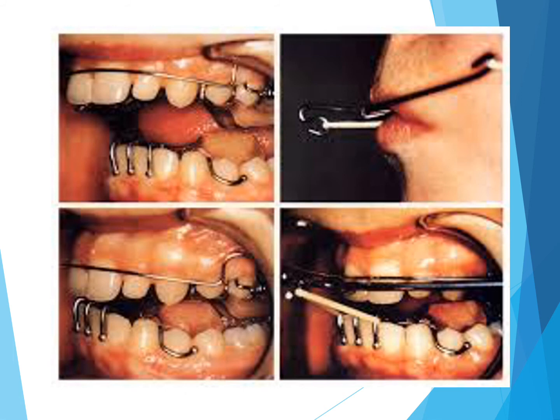Another additional part of the Concord face bow is a curved hook at the labial part of the face bow, where we will attach an intermaxillary elastic from the hook to the ball ended clasp of the lower plate of the twin block to give intermaxillary elastic force. The Concord face bow will also be attached to the headgear to give the extraoral traction and force.